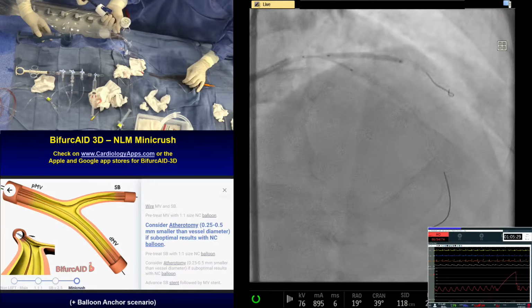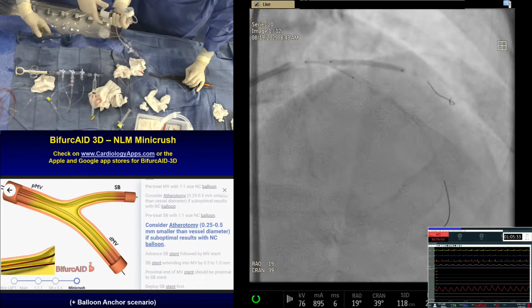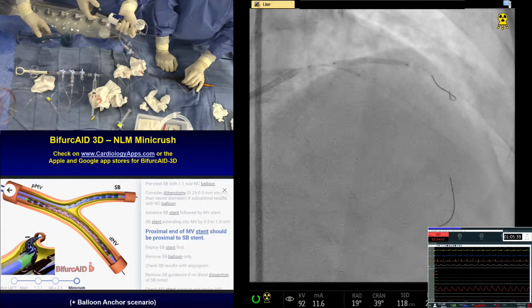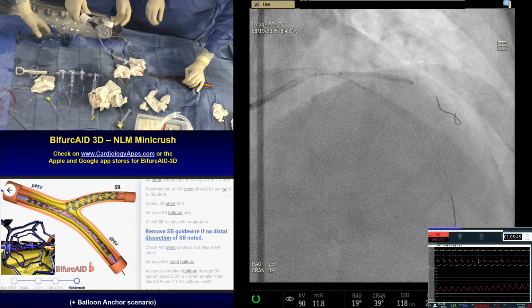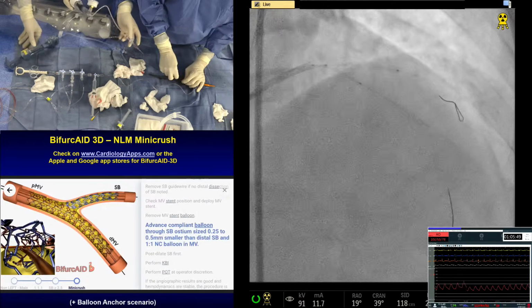Expansion of this stent is unbelievable. Look at the Orsero. Yeah. And that is why I think there was actually lower side branch closure and lower procedural MI in the trial. The thin struts make so much difference, and the trackability and such low profile.